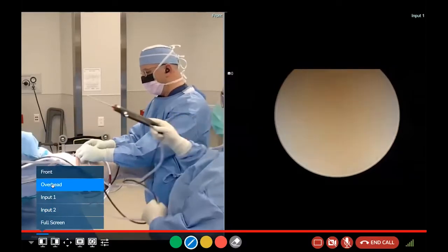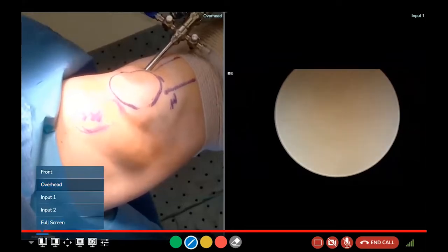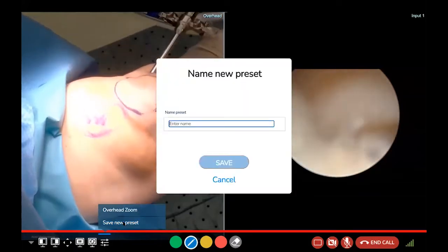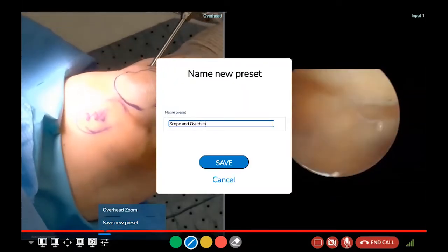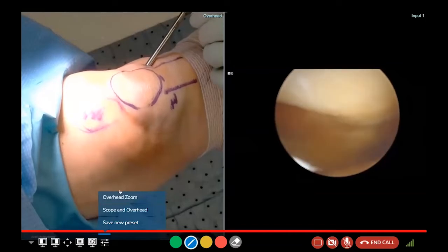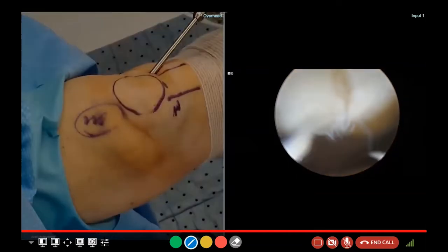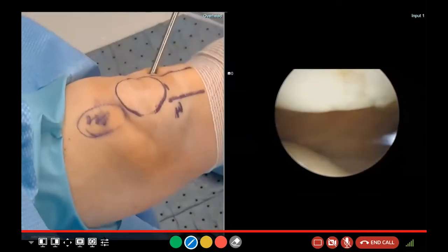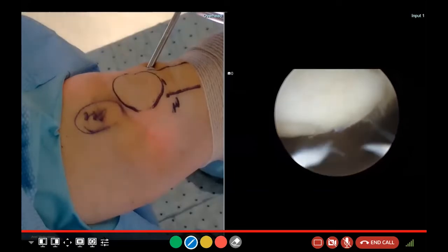The whole idea with arthroscopy is we're going to distend the joint with water just so we can see and look around. I wanted to particularly illustrate this case because even though it seems straightforward, this case can be a little bit controversial.